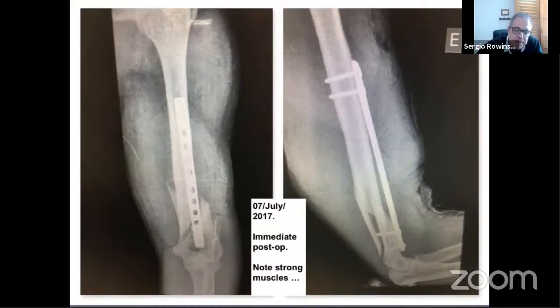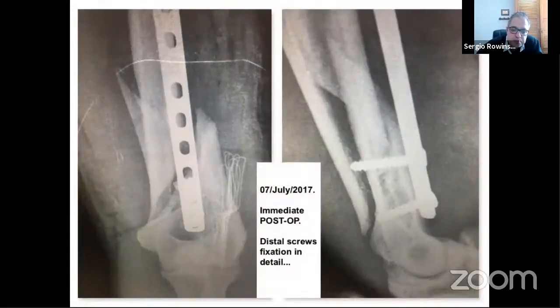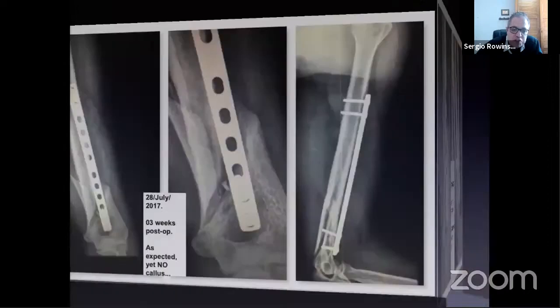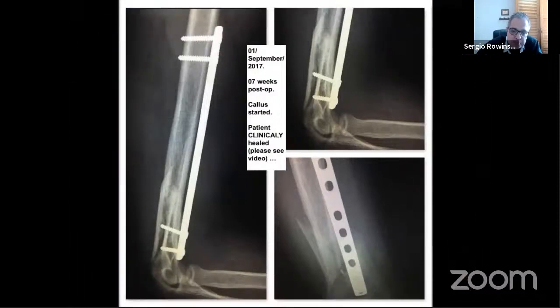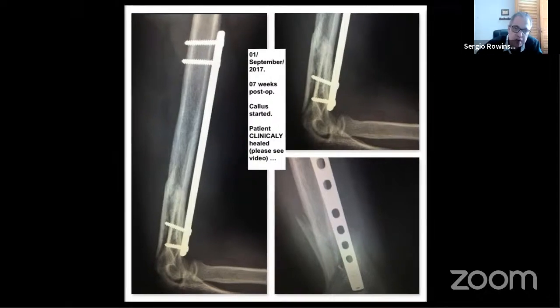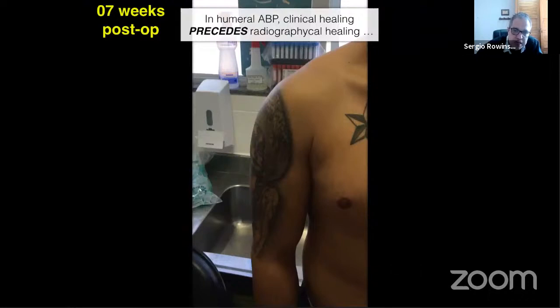1 week in a sling, and then 2 more weeks only flexion in a sling. And then after 3 weeks, I let them move because I have a cartilaginous callus. So this is the patient in the immediate post-op, or something like 1 week post-op. This is 3 weeks post-op, absolutely no callus. But now comes a very important image. Basically no callus at 7 weeks, but the mantra is clinical healing precedes radiographical healing. So this is written here above. Clinical healing precedes radiographical healing.